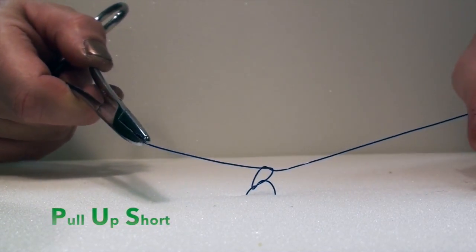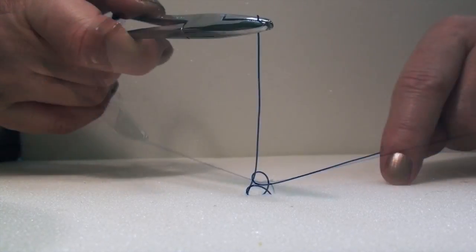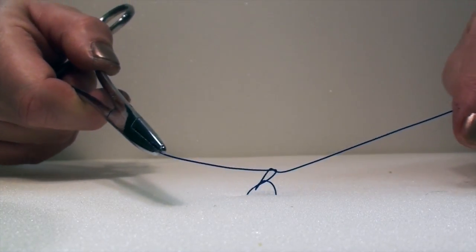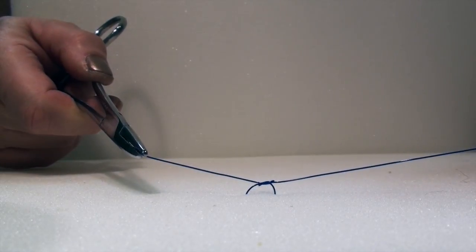Once you've achieved the desired tension, simply square the knot back by bringing the short end back to its original side.